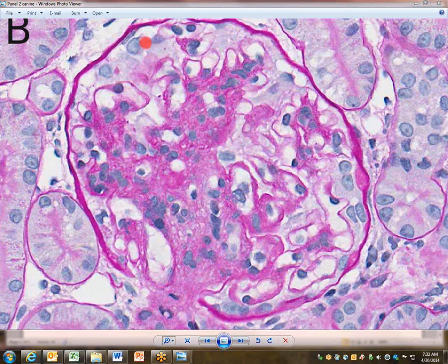We do have some hypertrophy and almost foaminess of the podocyte cytoplasm. Again, podocytes often get activated and reactive for many reasons. So both the mesangial cells and the podocyte prominence are somewhat nonspecific. In addition to the mesangial hypercellularity, you have too much mesangial matrix. The fact that I can fit 3 of these dots in there is too much mesangial matrix. It should be very fine, delicate, and lacy.